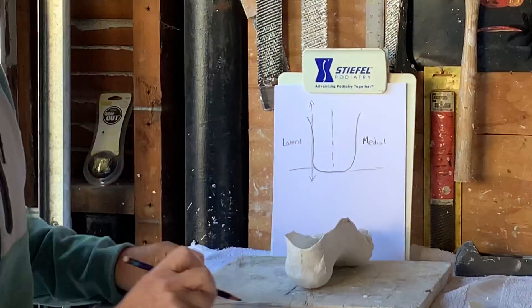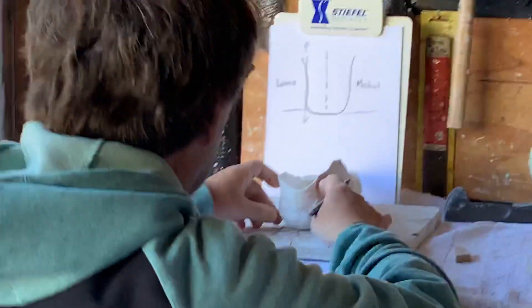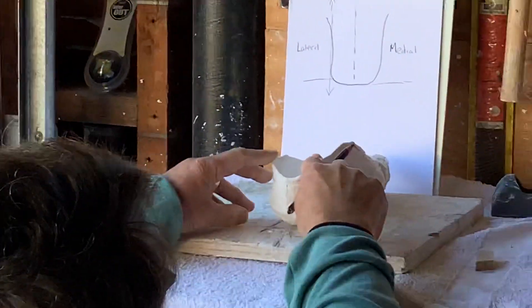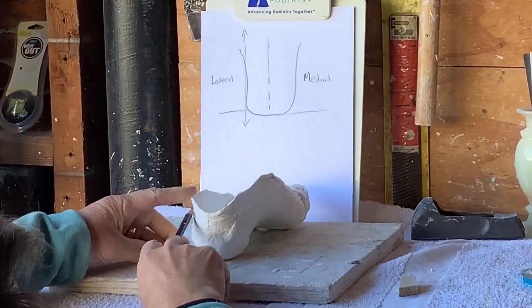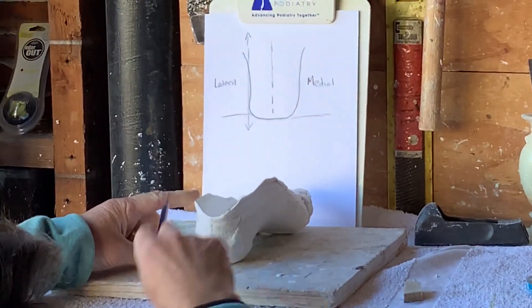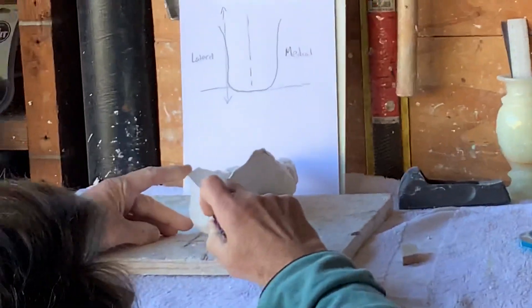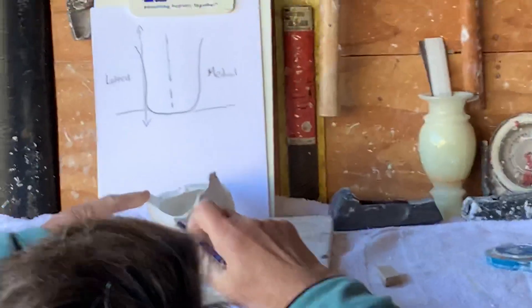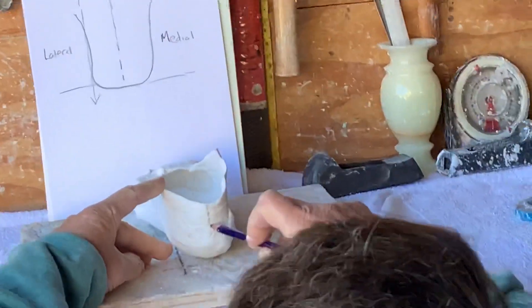Then we're going to put that curve where it's straight up and down and then represent that curve by a heel bisection.